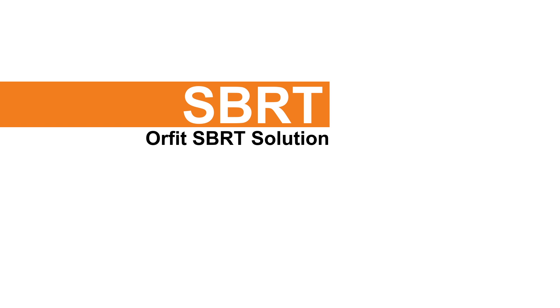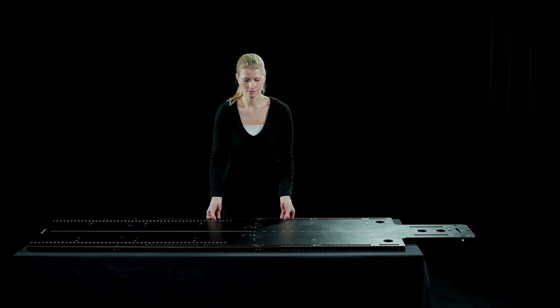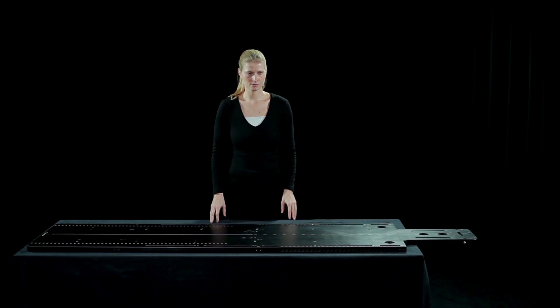The Orfit SBRT Solution. Attach the SBRT baseplate to the treatment couch. The fixation device to attach the baseplate depends on the couch top.